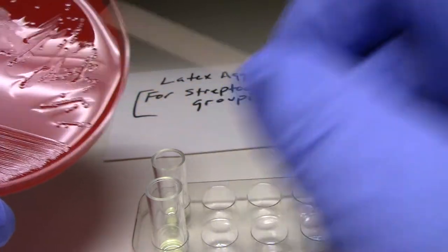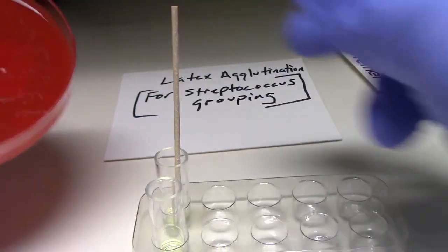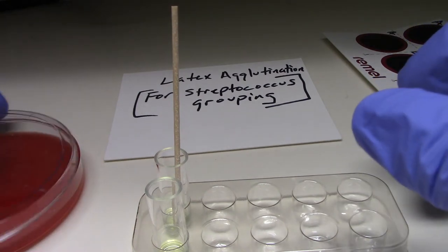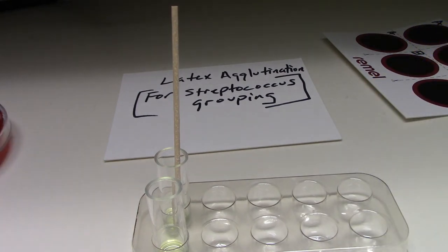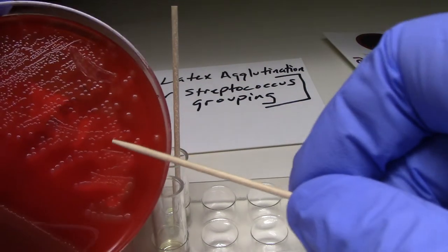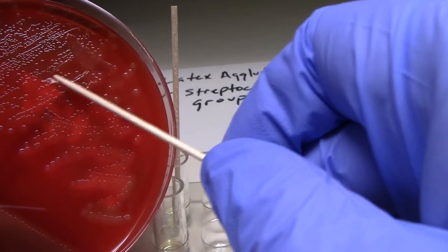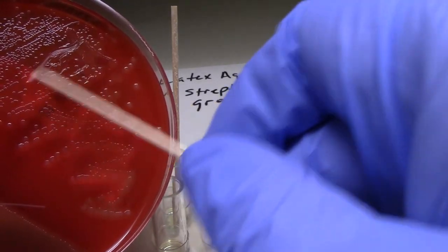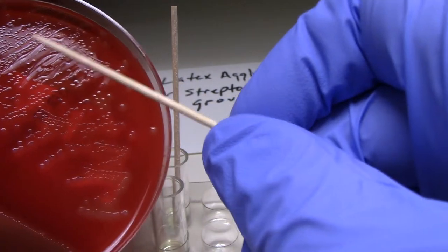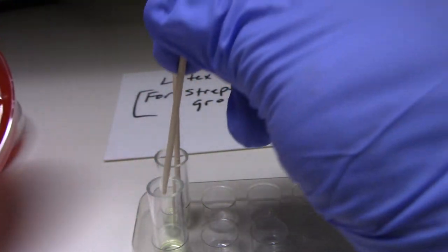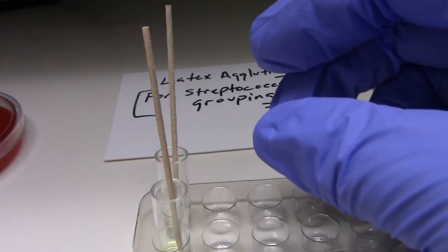So I'm going to pick some of these colonies off of the plate. I'm going to put these into the first well, or reaction cup, I should say. And then I have a second organism, a bunch of colonies. I'm going to take some of those colonies off of the plate and put that in the second reaction well.